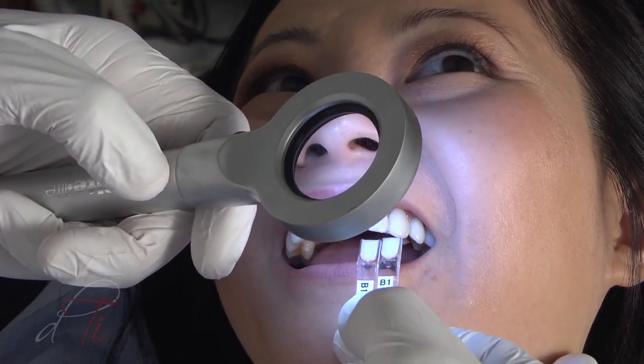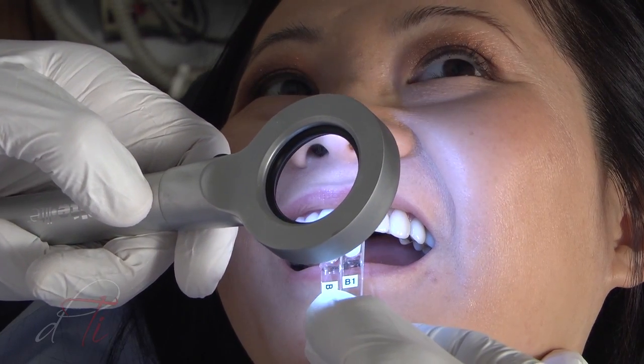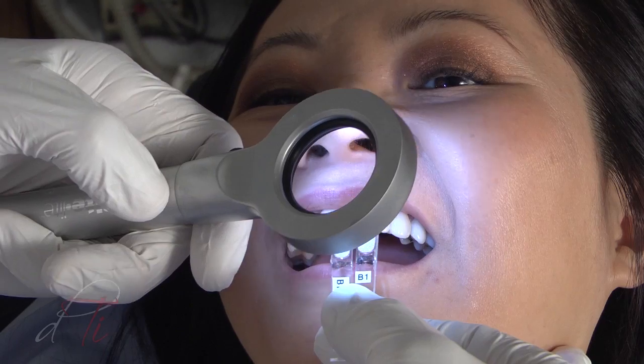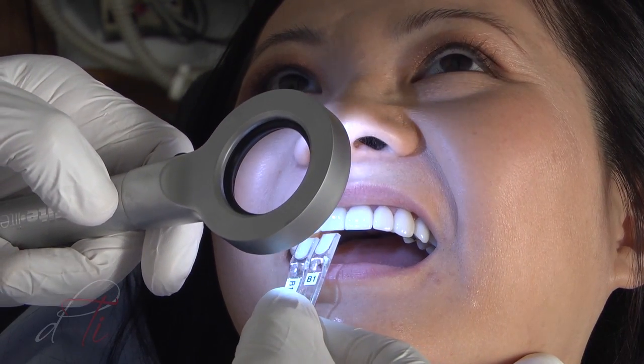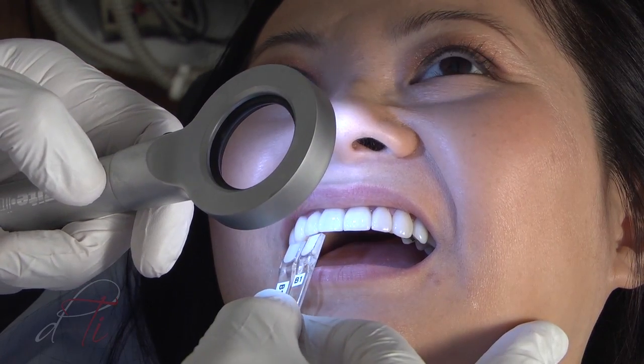An initial shade selection was performed for the fabrication of the provisional restoration. Custom shade tabs were made using the exact composite material to fabricate the provisional, allowing a more accurate shade match and a realistic representation to the existing ceramic veneers.